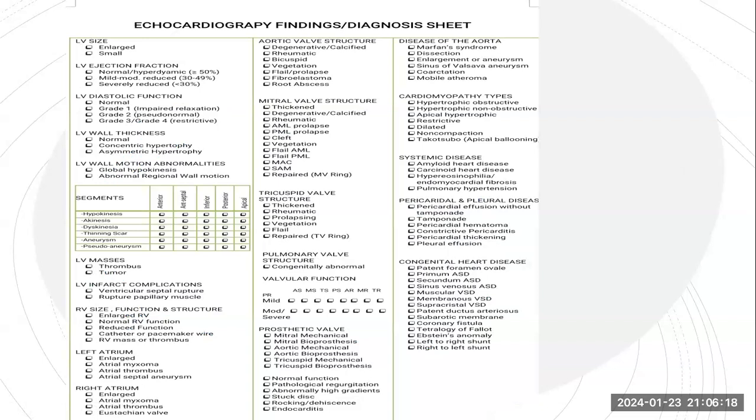My advice for you: if there is a finding that is very prominent and shining, you have to pick this one first. Especially in the OSCE, if you face an echo station, for example, where he brings you a Marfan syndrome or whatever, don't go and comment about the LV size or LV function while you have a very enlarged and aneurysmal ascending aorta, or significant mitral prolapse or whatever. So start with the most important finding, and after that you go to the less important.